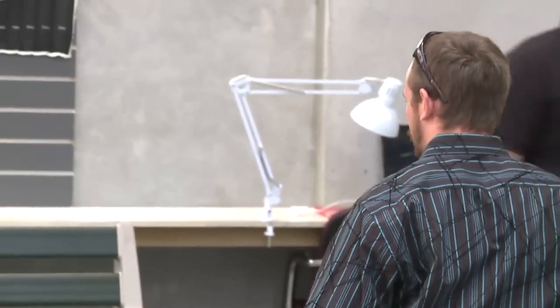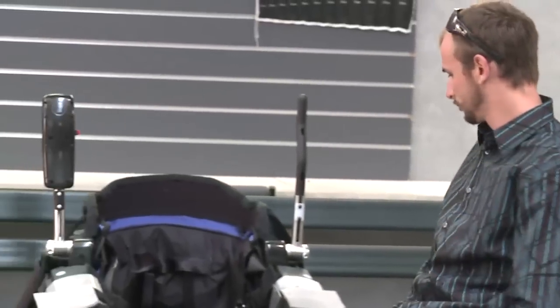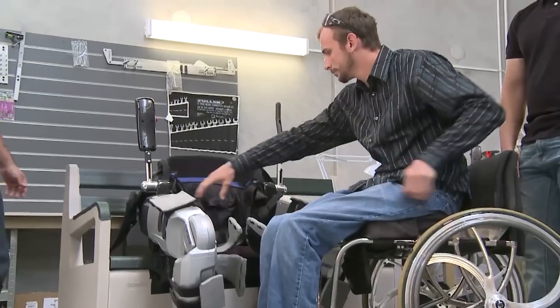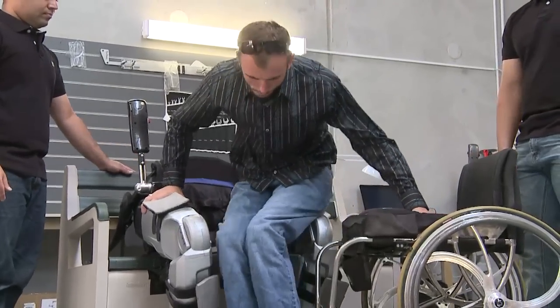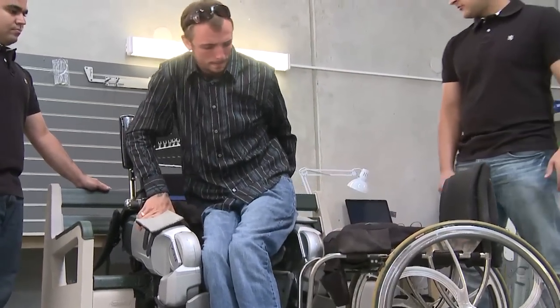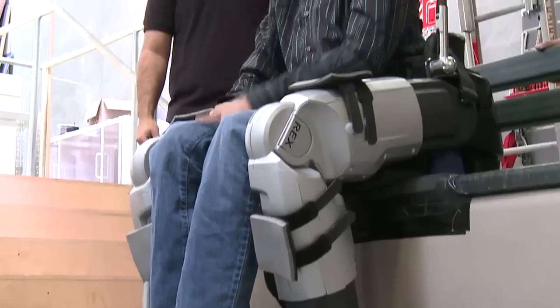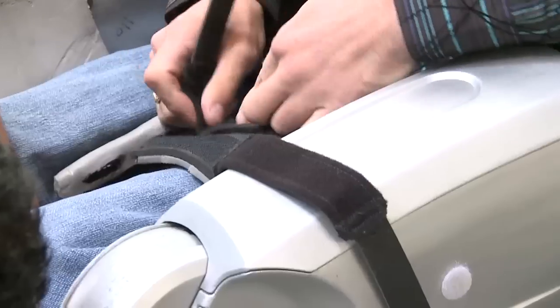Generally when I go to jump in the Rex, I'll wheel my wheelchair so it's at a 90-degree angle with the machine, and then I just make sure that all the straps are clear and I'm not going to sit on any buckles, because that makes it a little bit difficult to do them up. I self-transfer by holding onto the legs of Rex and just lift myself across to get my own legs sitting in the cuffs. From there it's about five minutes all up to get yourself strapped up and ready to go.